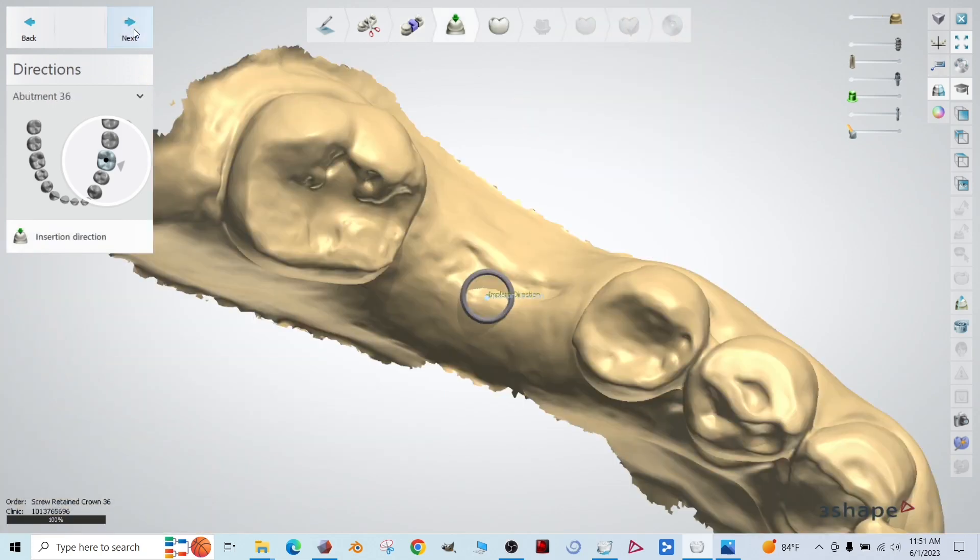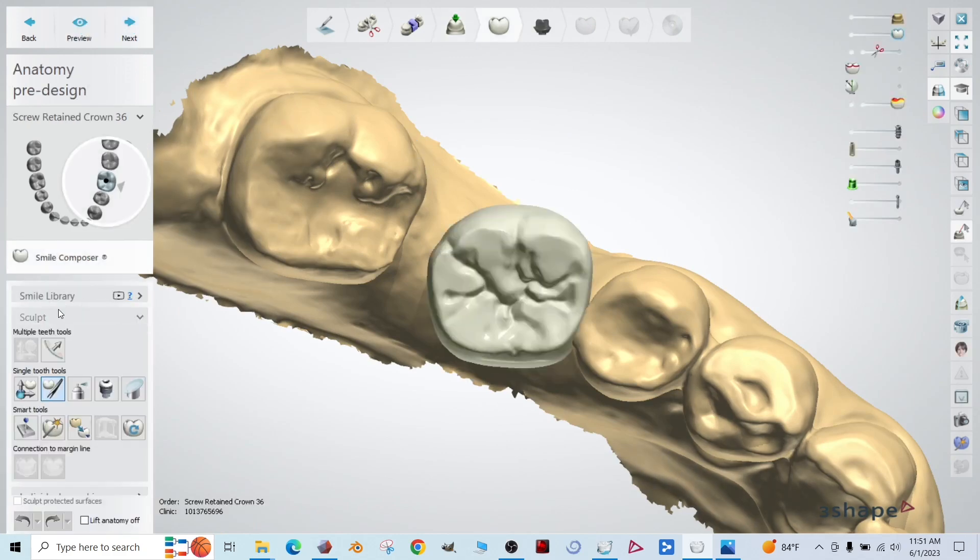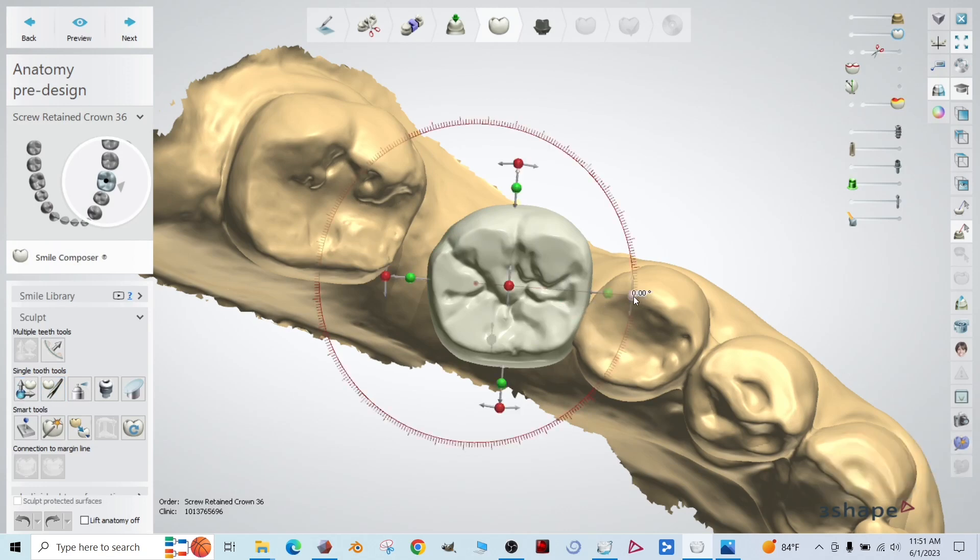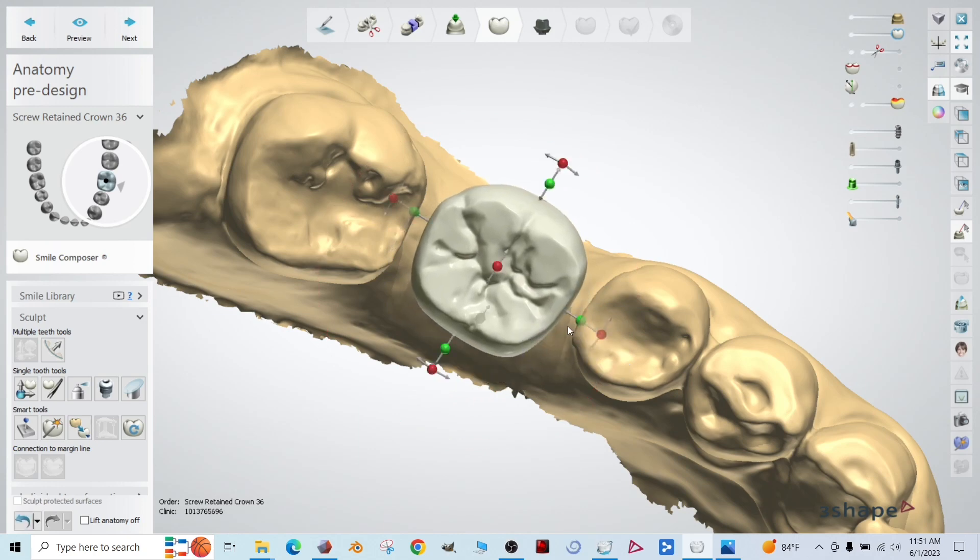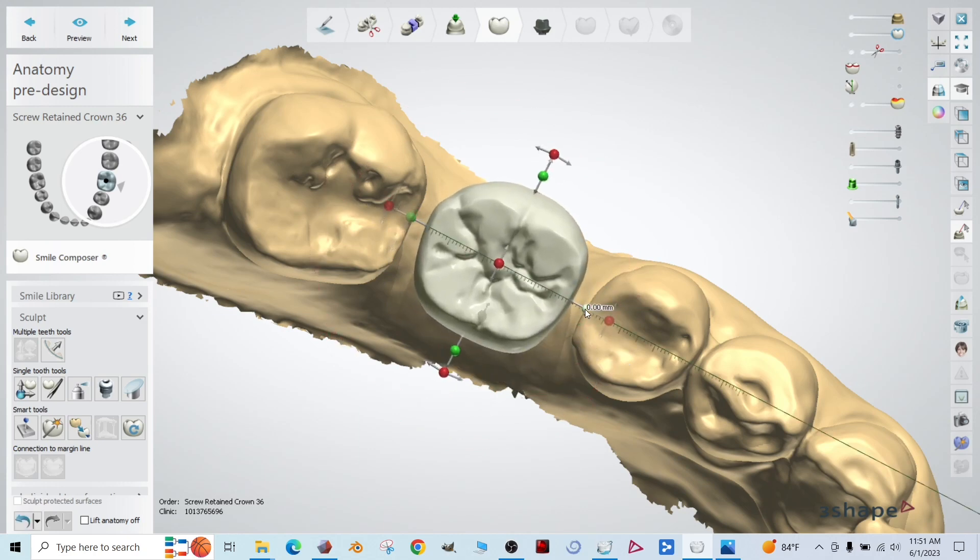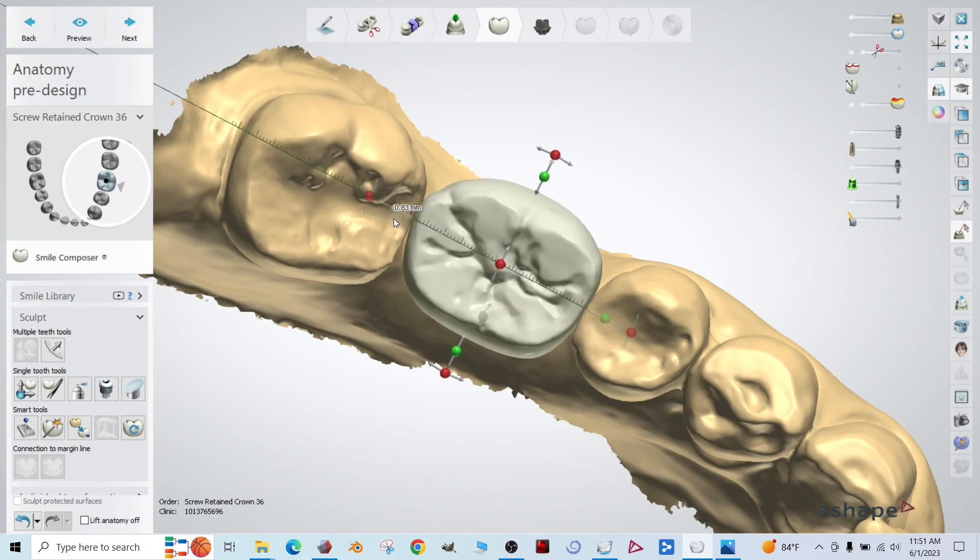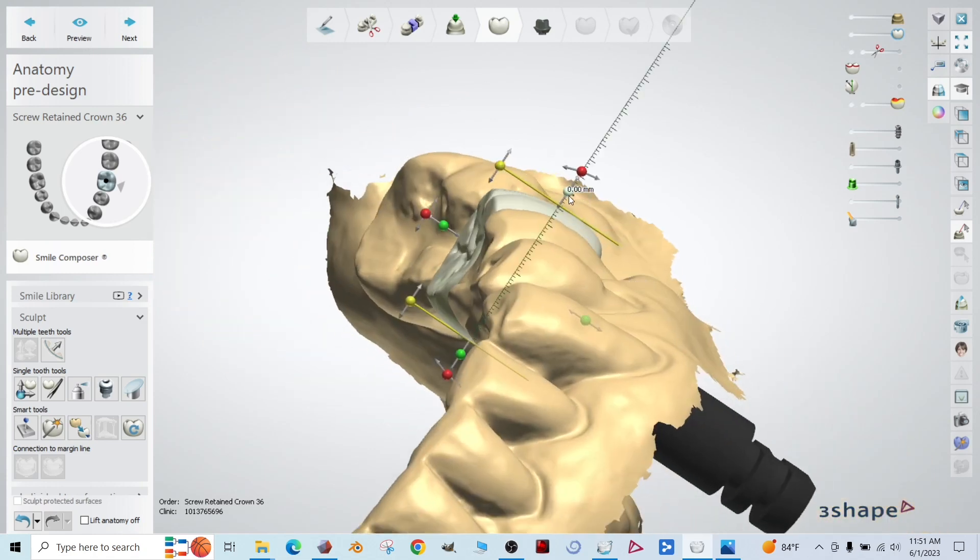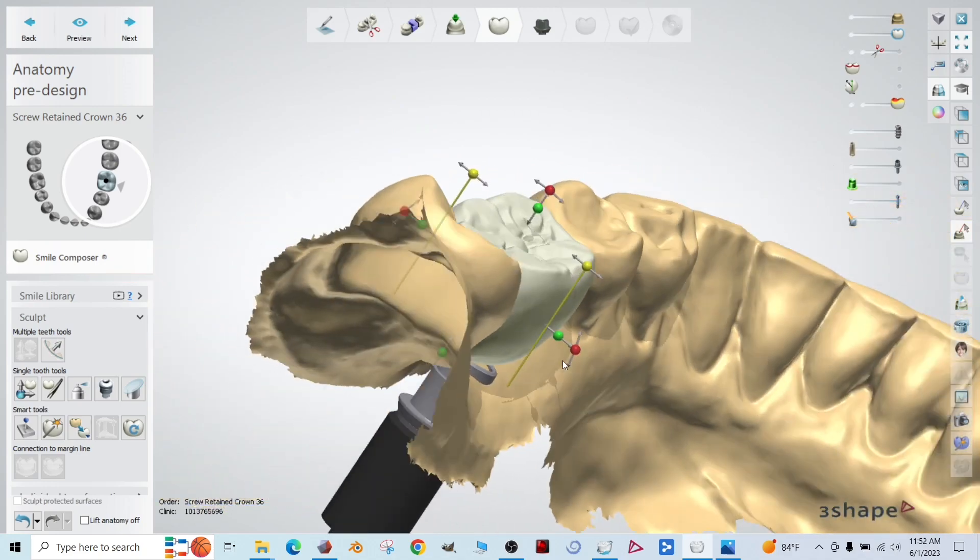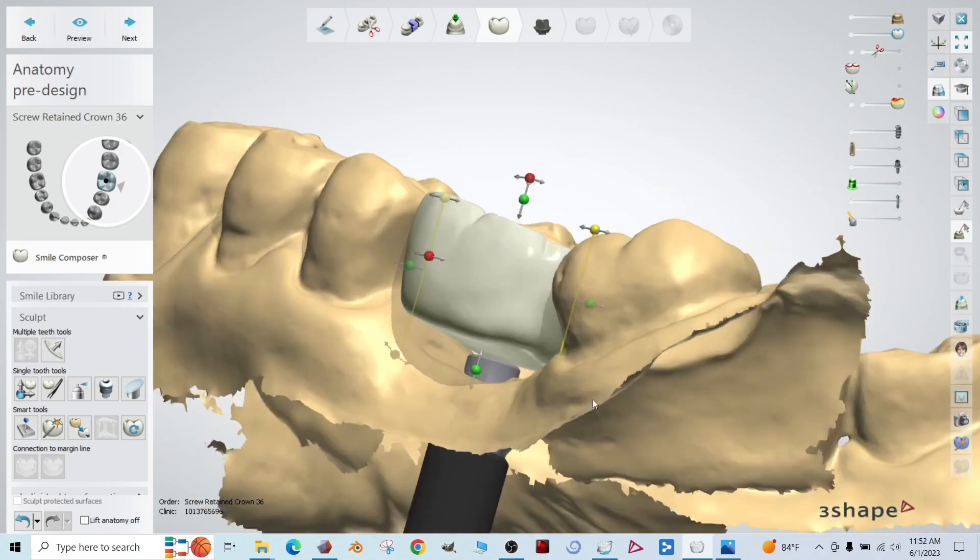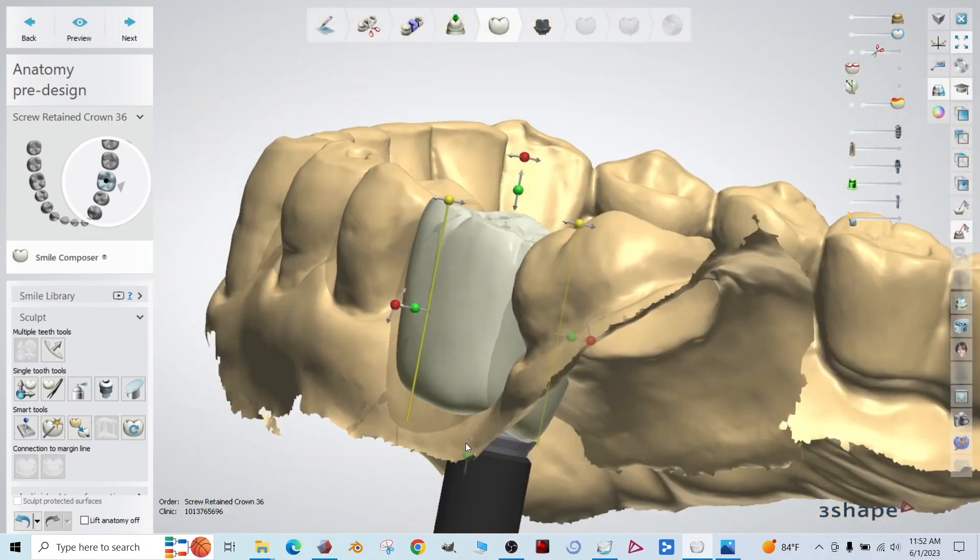All right. So this is all based on that virtual plan. There's our implant and then there's our tie base. Click next. And click next.